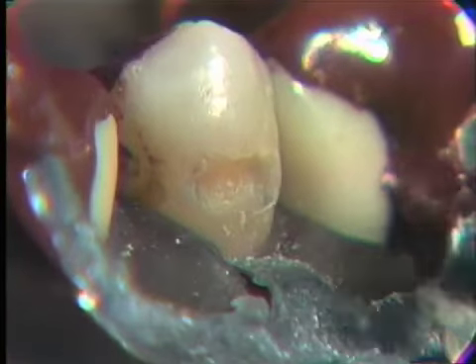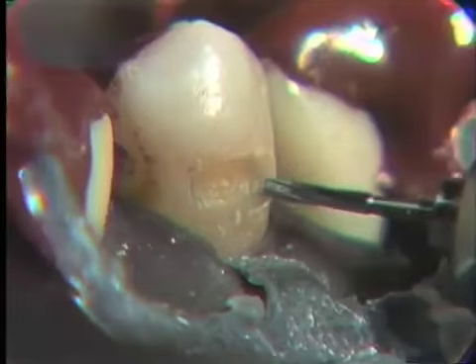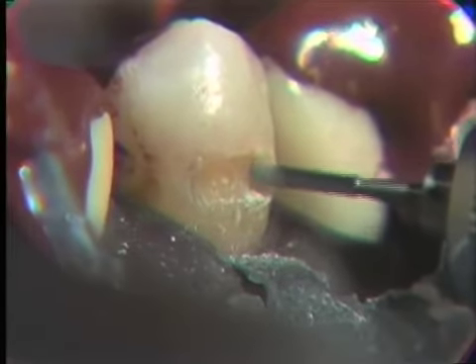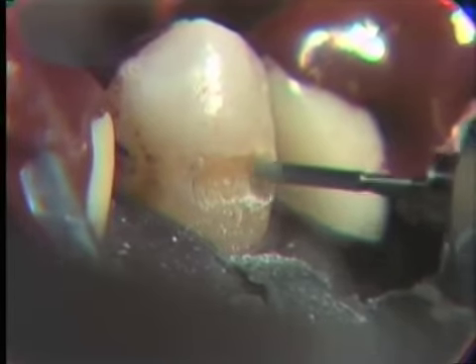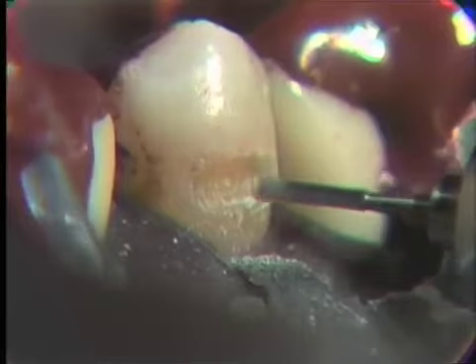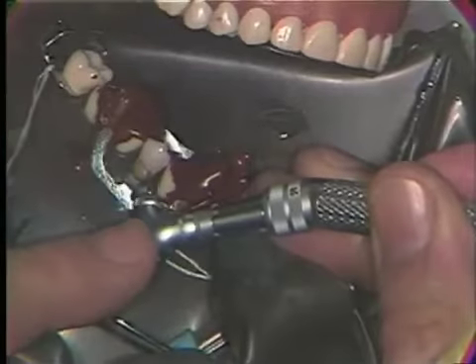Trying to get rid of any overhanging enamel rods or any roughness to the enamel surface. Notice the brush-like stroking motion of the burr as you're cutting. We're supporting our burr with two hands. That just ensures steady cutting.